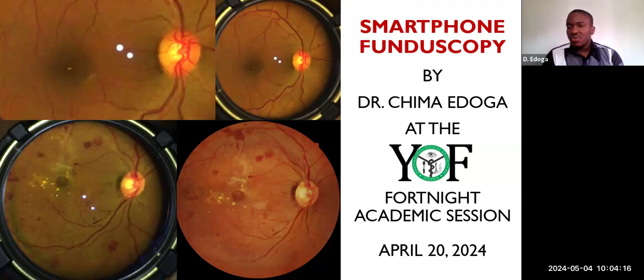I also wanted to let us know that you need to limit the amount of time you expose the retina. Usually, for people that are starting, make it under 1 minute and then allow the patient to rest. But when you begin to gain proficiency, you can actually image the retina in under 20 seconds.